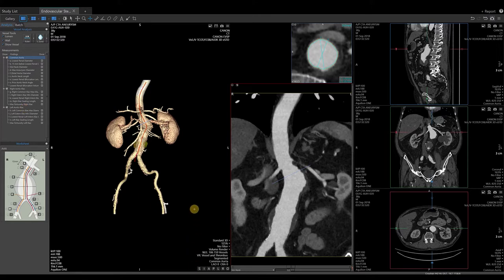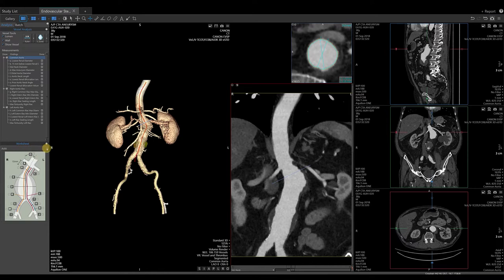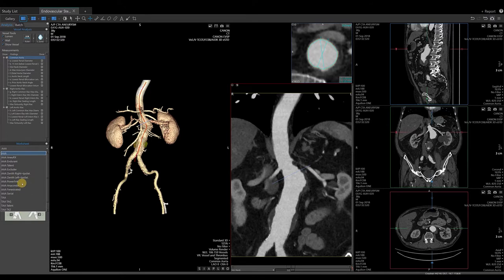Probing vessels, whether it's an automatic feature or a manual process, allows for easier measurements of stenosis and vessel analysis. On the left-hand side of the screen, you'll see our work list or measurement list. Just below the measurement list and above the diagram, you'll see AAA. Select the drop-down to select a different work list. For this training video, we'll use the default AAA worksheet.